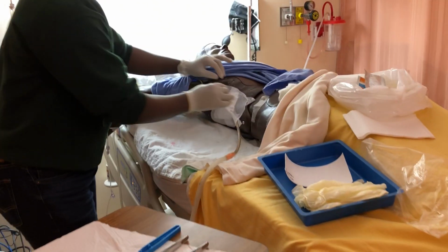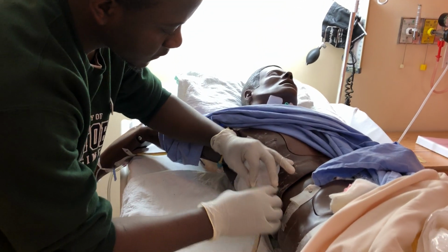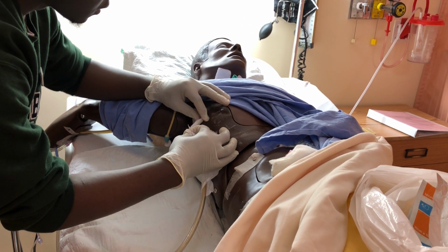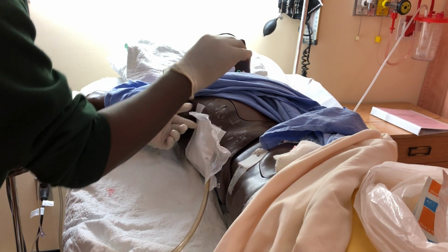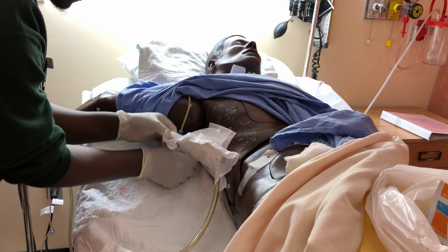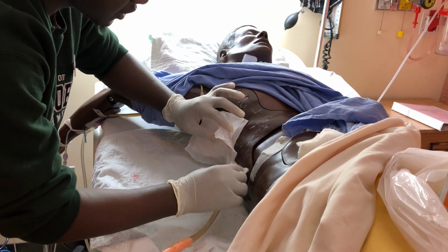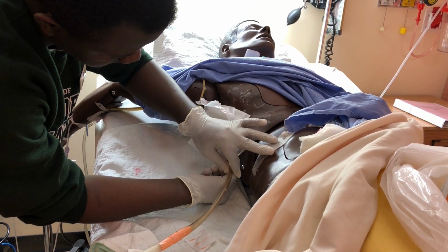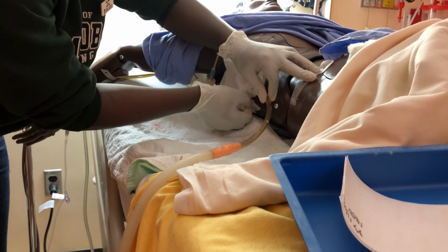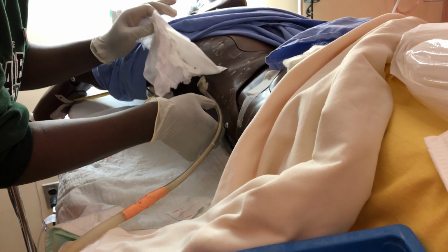So I will then open my chest tube dressing gently and inspect. It's looking pretty clean, but just because I touched all that equipment, I'm going to put on another pair of gloves and make sure it's all clean. Now I will explain to the patient that I'm going to be changing his trach dressing and his inner cannula, but before that I have to pre-oxygenate him. I also gently have to make sure I don't dislodge the chest tube, making sure to keep it stable. So I'm just going to let him know to take some oxygen and take in 2 or 3 deep breaths, and just breathe gently. Okay, so I'm just going to turn this on all the way. Okay, so take 2 or 3 deep breaths.